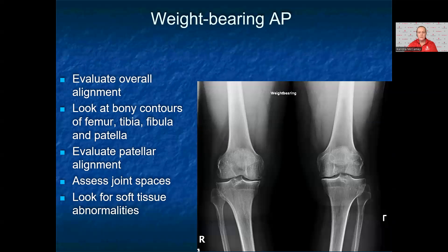The weight-bearing AP evaluates overall alignment of the knee. When reading this x-ray, look first at overall alignment. Next, evaluate all bony contours of the femur, tibia, fibula, and patella. You can start by tracing the outline of the bone itself, looking for any irregularity on the bony cortex. Irregularities you may see include fracture or osteophytes, which are seen in degenerative joint disease. You then want to comment on the bone itself, noting any abnormal findings. The patella will be more difficult to see as it lies over the femur, but you still need to identify and comment on it. You should also note if the patella is not centered in the middle of the femur, sitting more laterally or medially than normal.